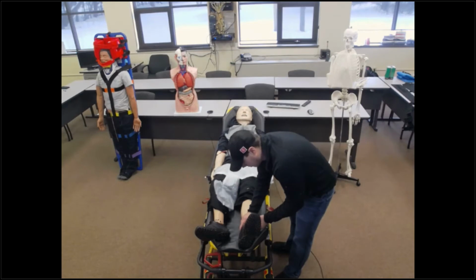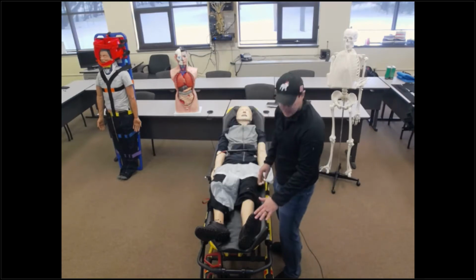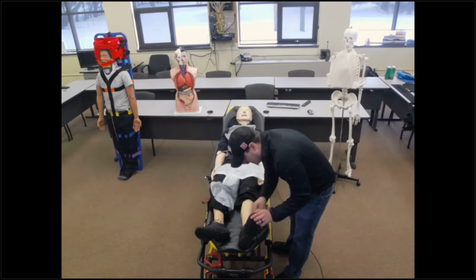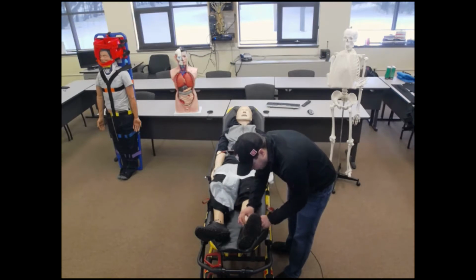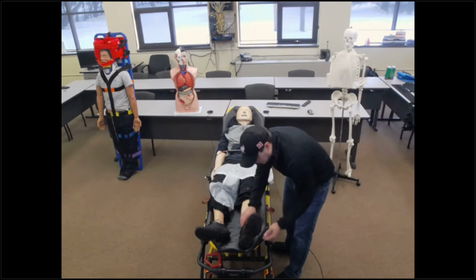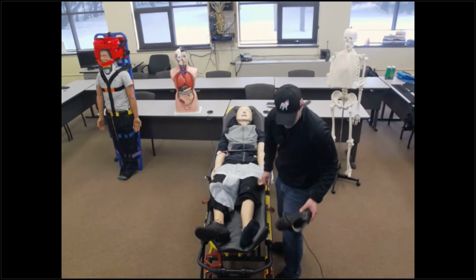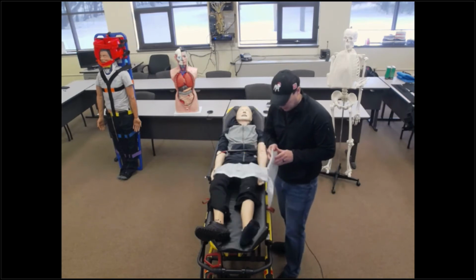Now I'm checking the ankle, okay, ankle seems soft. There's a contusion there, patient's complaining of pain at this point. So you notice that these specific shoes do not offer any type of ankle stability. So what I'm going to do is I'm going to remove the patient's shoe very carefully. This is going to probably cause them some type of pain. Now, if you have a patient who has a substantial boot on already, so big work boots, something along those lines, you can go ahead and leave that boot in place because it provides quite a bit of stability from that. I'm going to go ahead and apply my splint.